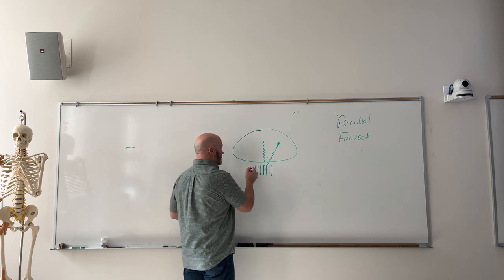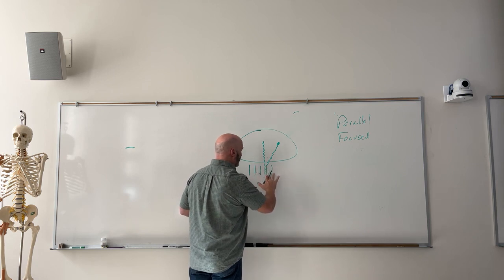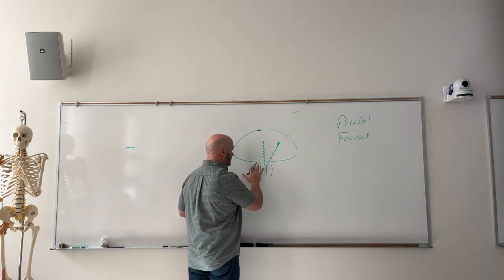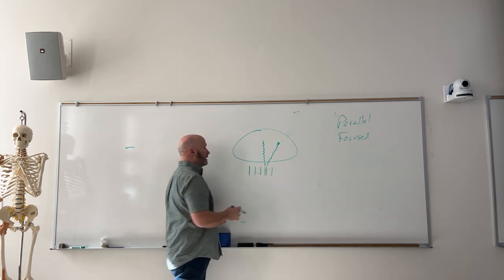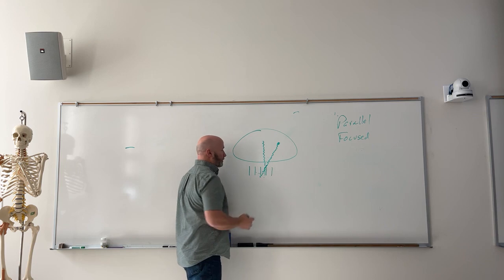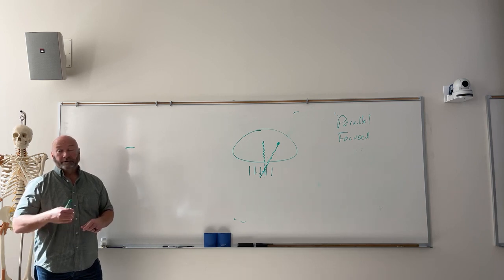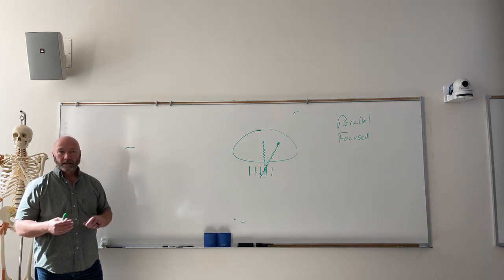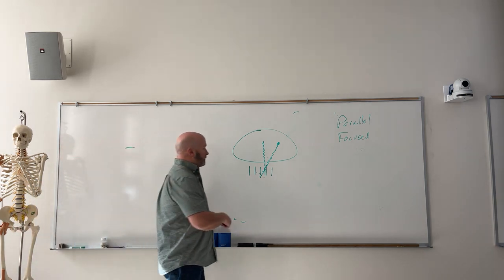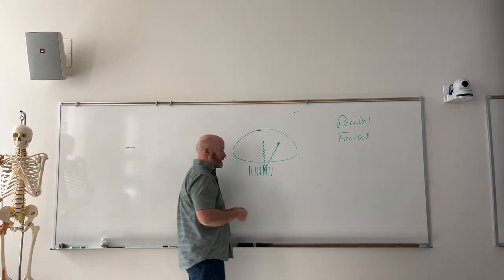All right, so what we can do is we can take the grid strips and we can kind of spread them out. So now, instead of our original grid, we've got grid strips that look more like this. And let's say that this grid is that tall. Would this X-ray photon now make it through and strike the image receptor? Answer is yeah. So is that effective? It's effective at transmission, but is it effective at absorbing that wide angle X-ray? Answer is no, it's not. Right? So if we have more lead strips in there and these little hallways here are more narrow, does that increase our efficiency?